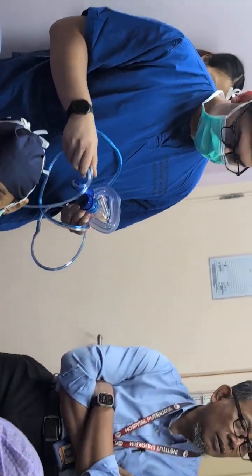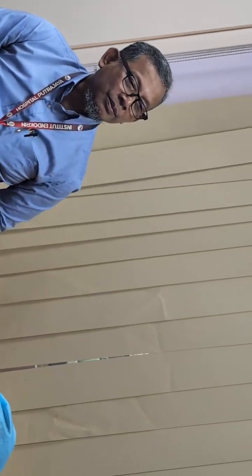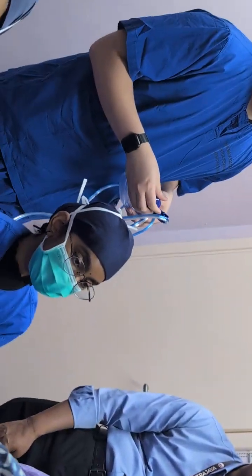Okay, it's very good. And if you have patients, not if, I'm sure you have patients, okay? You want to try this? Doctor, I'm willing to give you the sample. I'm willing to come and teach you guys how to set up. I'm not going to give you this one because it has been in and out many times. Okay, I'll give you a new one. Are there different sizes? Yes. Different sizes. S, M, L, XL. In Malaysia, we only buy M and L. S is too small. XL is too big.